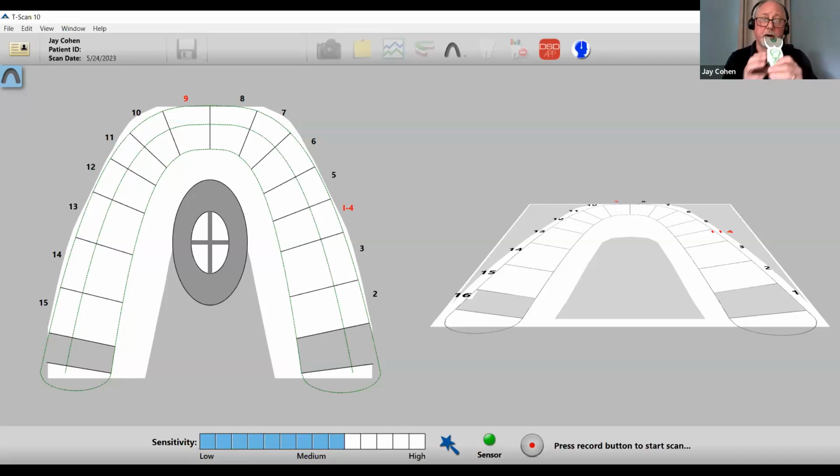So we're going to place it in the mouth. Just another note, this is the position guide, that plastic point in the middle. You want to make sure you touch that between the upper central incisors, kind of halfway up the tooth surface, not under the incisal edge. We don't want them biting on that, but we want that to physically touch between the central incisors. So I'm going to go ahead and do that.